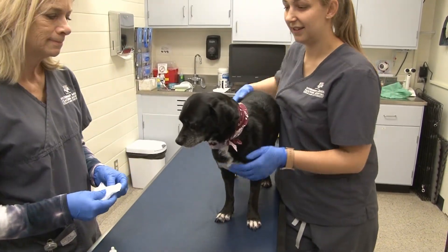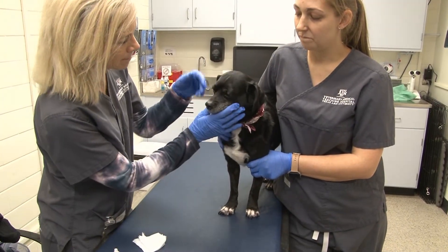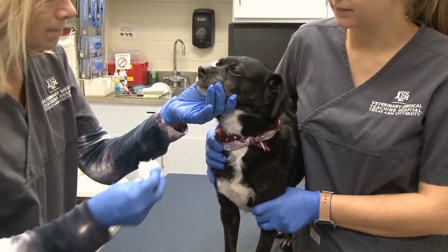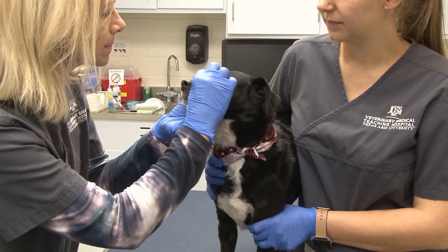The technician is going to examine the animal for presence of discharge. If she notes any discharge, she will either use a cotton ball or a gauze sponge to wipe it away. She will gently wipe away any discharge from the patient's eye.